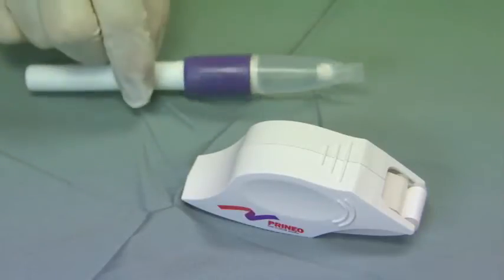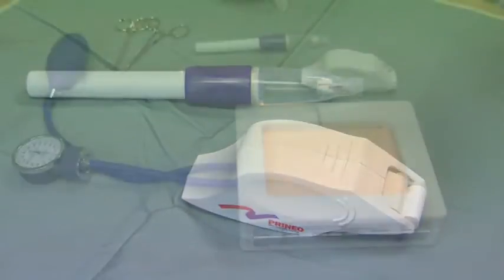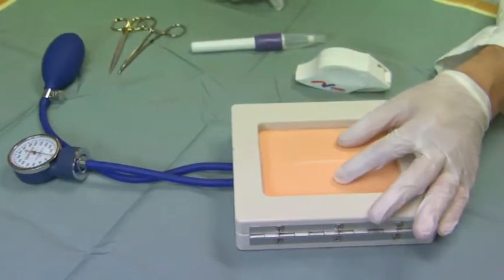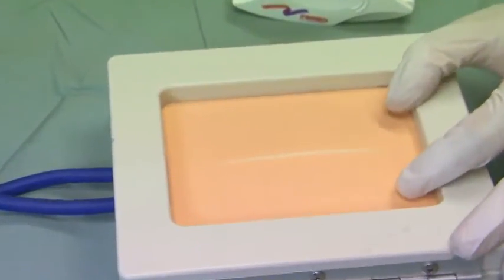The second component is a pen which contains 2-octyl cyanoacrylate. This simulates our incision, and as you can see the incision is well approximated with deep dermal sutures. It's clean, dry, and hemostatic, and now we'll apply the mesh.